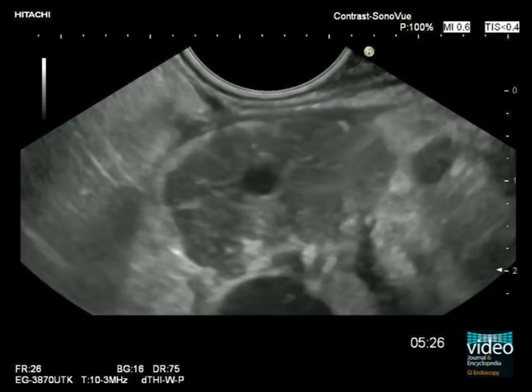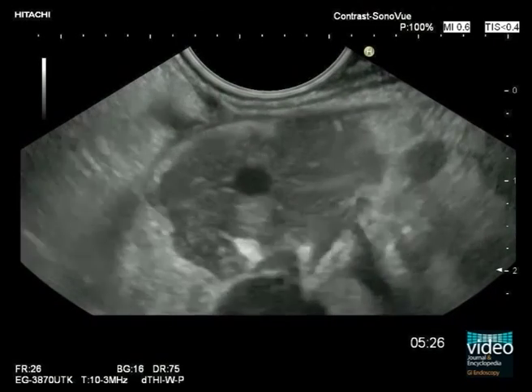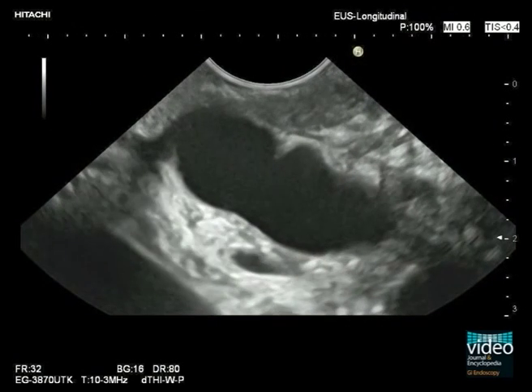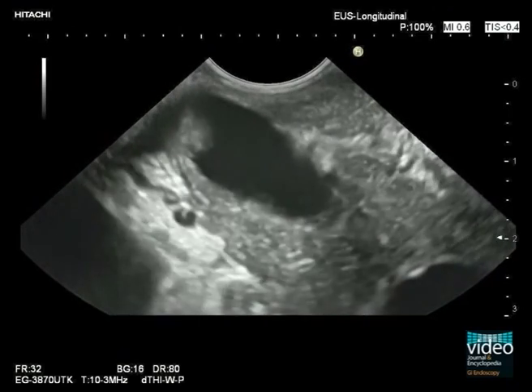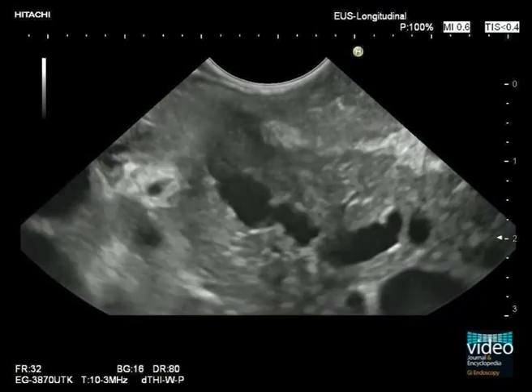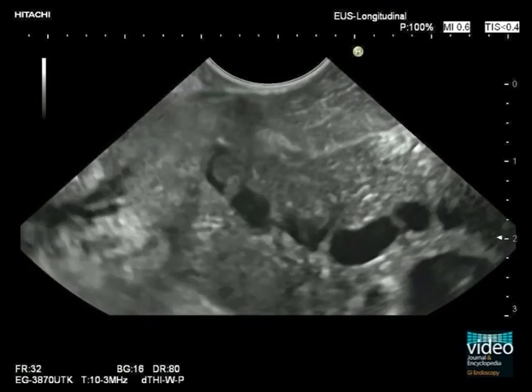Solid pancreatic tumors rarely induce acute pancreatitis. In this case of a 50-year-old female patient with recurrent acute attacks of pancreatitis, chronic alcoholic pancreatitis was initially assumed. Longitudinal EUS shows peripancreatic exudation, ductal dilatation, irregular lobulation, and hyperechoic reflexes of the pancreatic parenchyma, consistent with an acute attack of chronic pancreatitis.